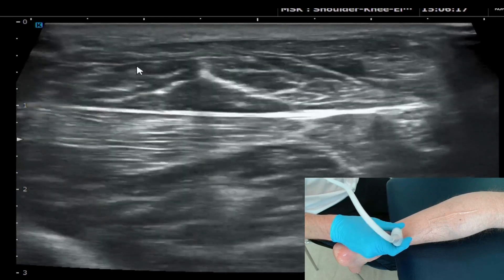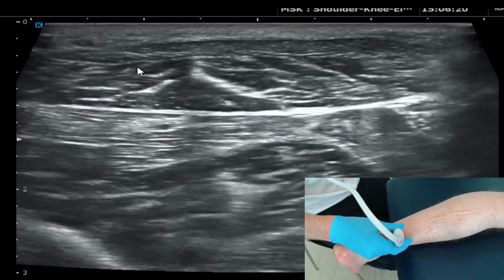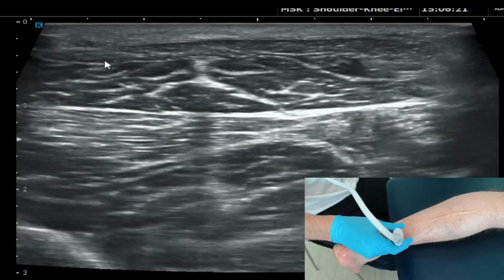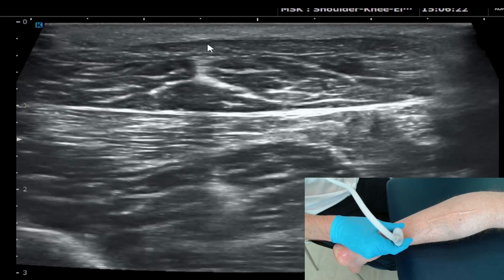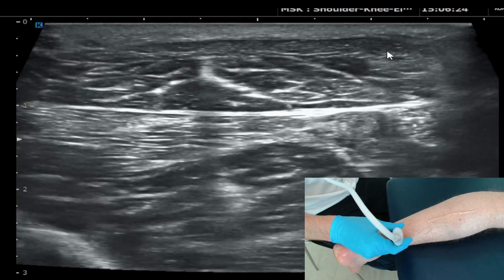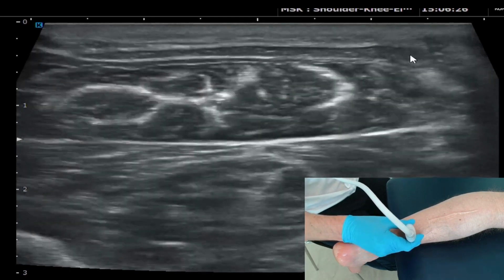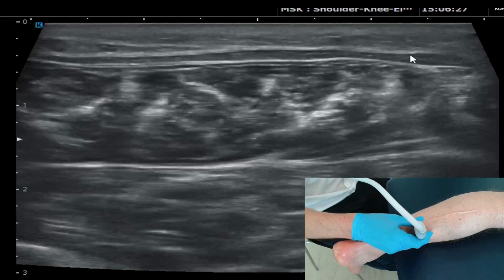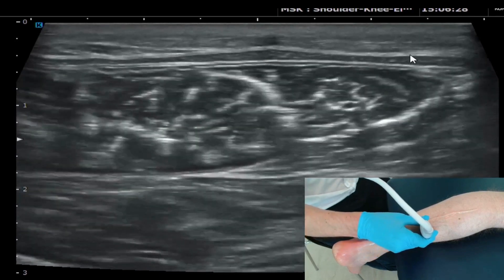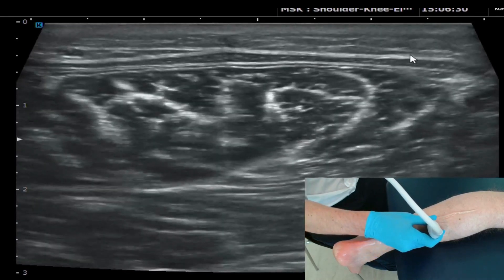You'll see how the Achilles starts to spread out as scanning moves more proximally, and ultimately it comes into the aponeurosis that will cover the whole width of the probe, thinning out across the screen.